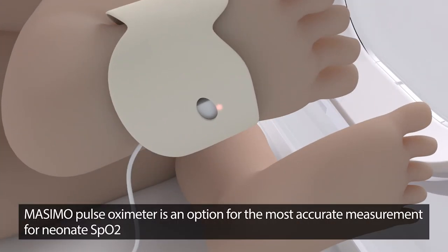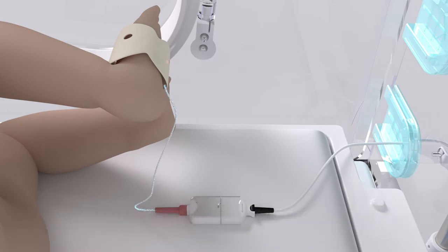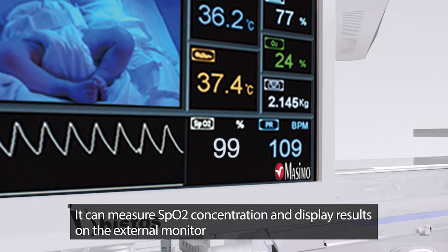The Masimo Pulse Oximeter is an option for the most accurate measurement of neonate SpO2. It can measure SpO2 concentration and display results on the external monitor.